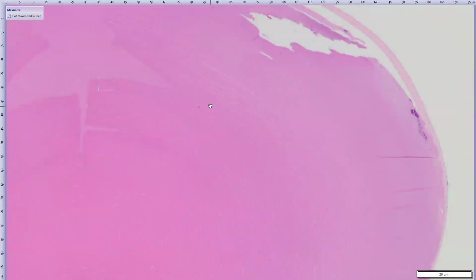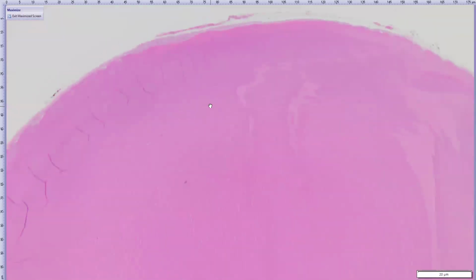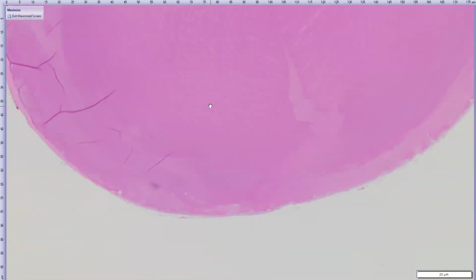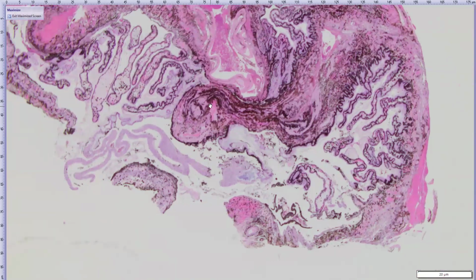Usually our cataract designations are not always correlated with what they're seeing clinically because we get usually one section of the lens, although in this case we have three because of the way that we sampled it. So it's a little bit different designation than, say, a clinical cataract.